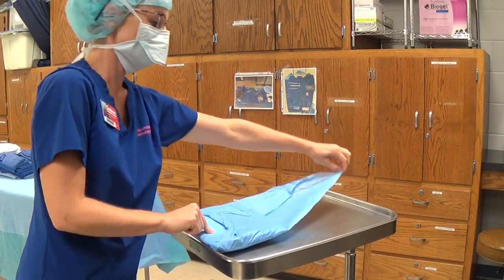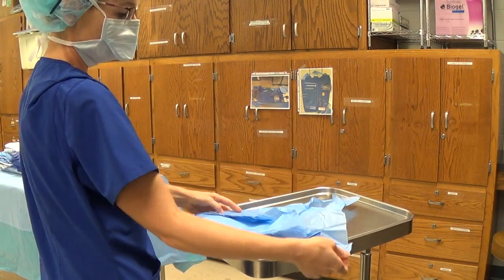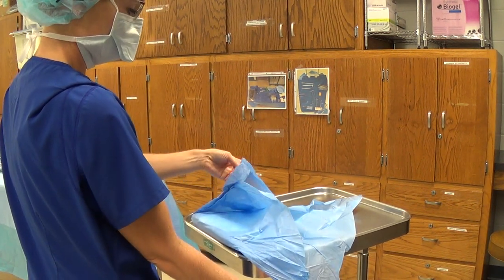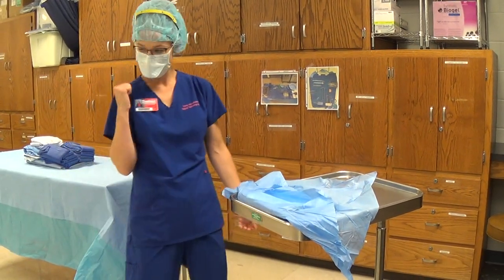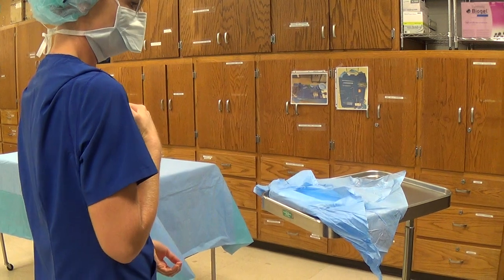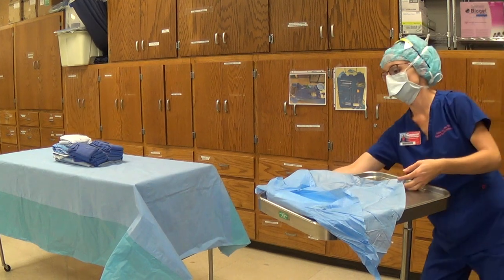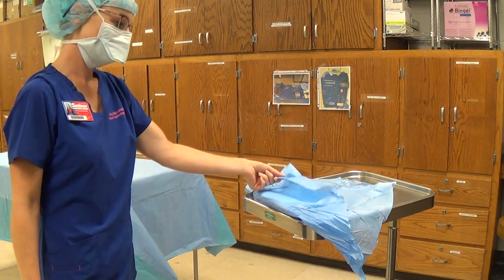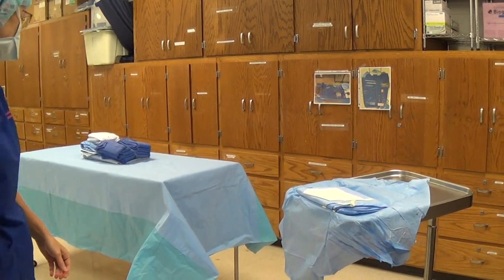She's going to open the first flap away, tugging it a little bit. We do have a gowning and gloving video for you guys to watch as well. Opening up the corners as they are in the wrapper, pulling them down a little bit just to take that memory out, being careful that none of the other corners flop back up. A big mistake that students make is going in between their mayo stand and their back table. You can come around the outer edge or walk around the back, but you cannot walk in between your mayo stand and your back table. The last corner should open towards you, watching those sides to make sure they don't flop up. That's how she opens her gown.